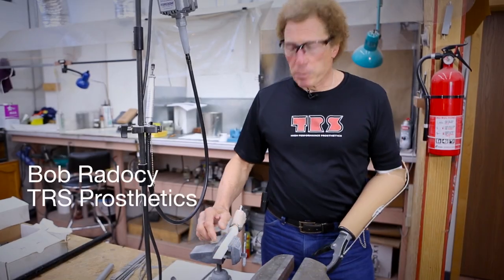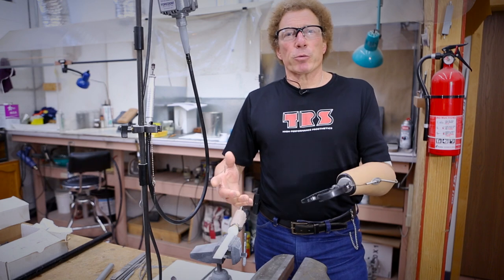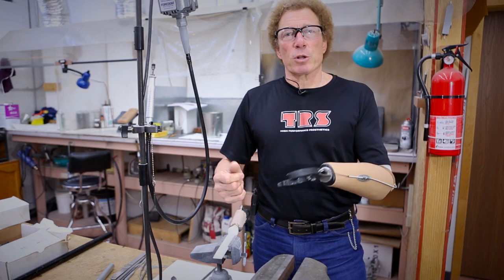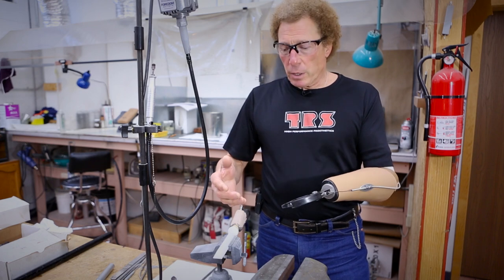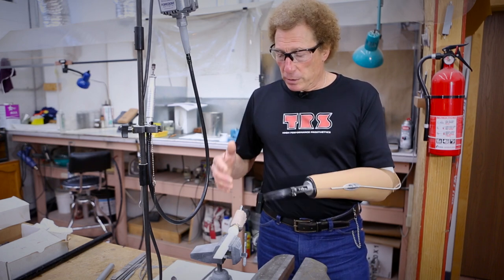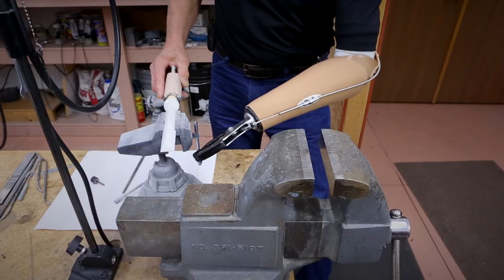Hi, I'm Bob Radosi. I'm here in the labs at TRS, and I'm going to be going through a variety of tasks illustrating how a voluntary closing prehensor is used in a variety of assembly tasks using a variety of different tools.